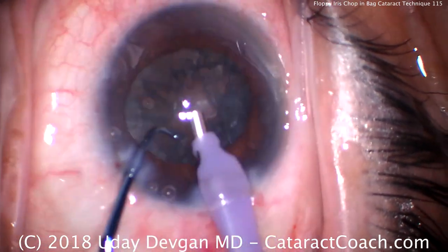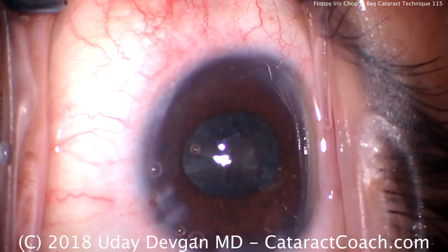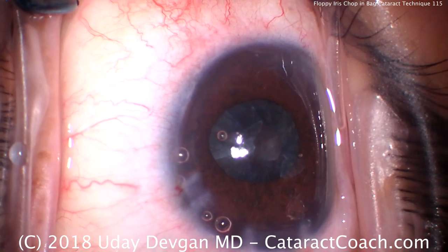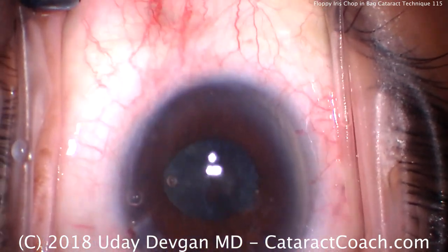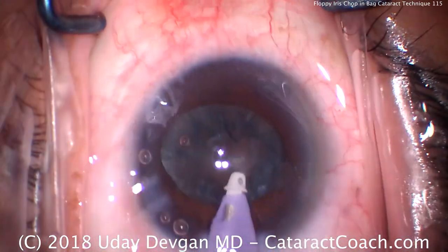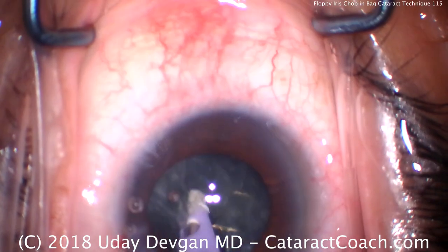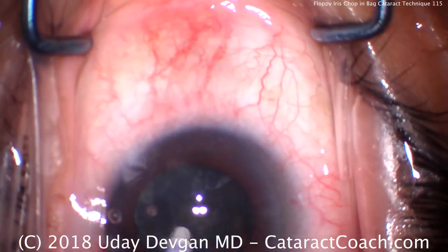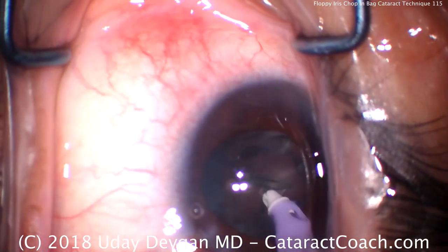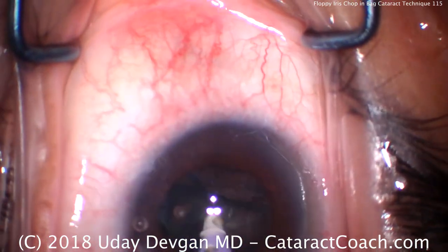There's a little epinuclear shell here — we should probably use the IA probe instead. We ended up doing a hydrodelineation separating the endonucleus, used the phaco probe to remove that endonucleus, and now we'll take the IA probe. You can see the pupil come down even more. This patient certainly has a strong history of Flomax use and does have floppy iris syndrome, or IFIS. Using the IA probe, it's pretty thick — that's the epinuclear shell. We'll take our time using high vacuum, going around, trying to loosen up this big epinuclear shell. Once we've loosened it up, the whole shell should come up and we can aspirate it quite efficiently.